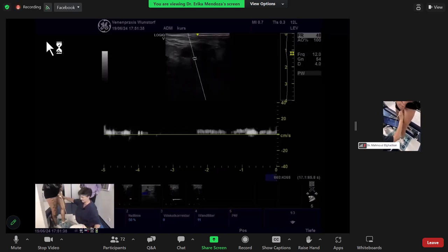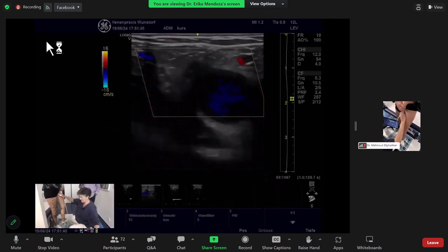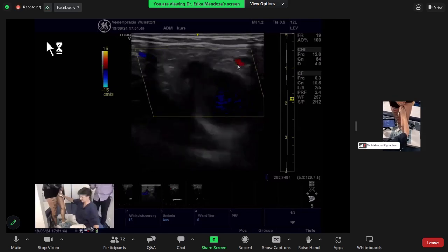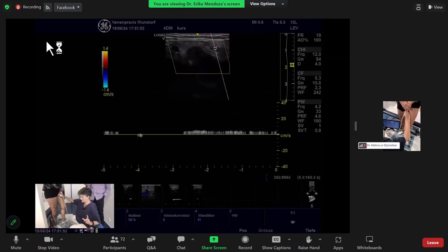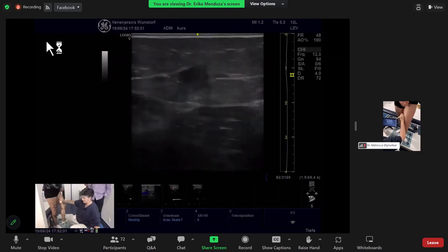That's a very good demo. And if you put the color, you can look very well. Here you see flowing, flowing, flowing. This tributary is guilty. You see that? Very clear. So sometimes it takes time to do it, but it clarifies perfectly where the flow comes from and where not.